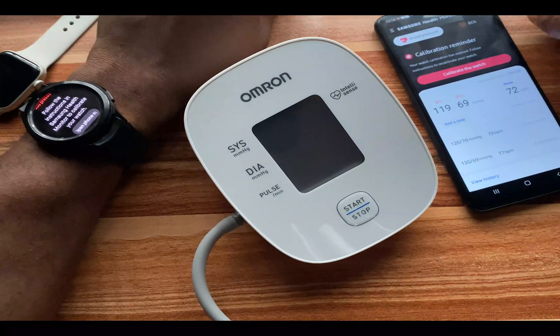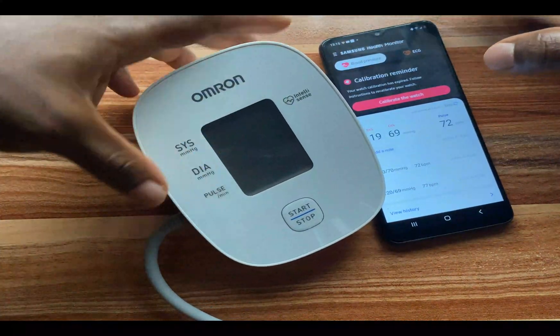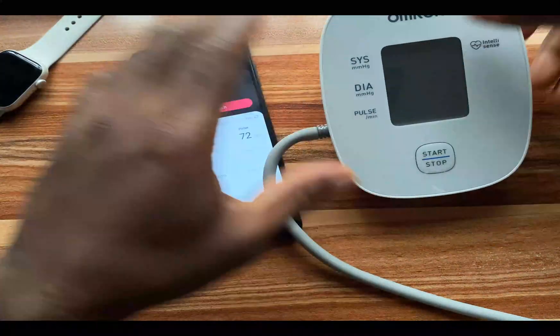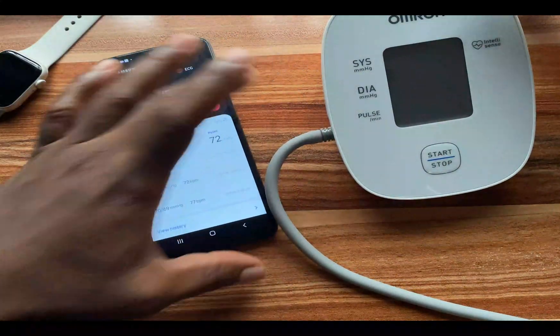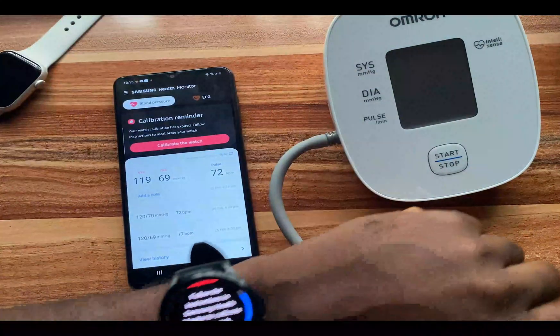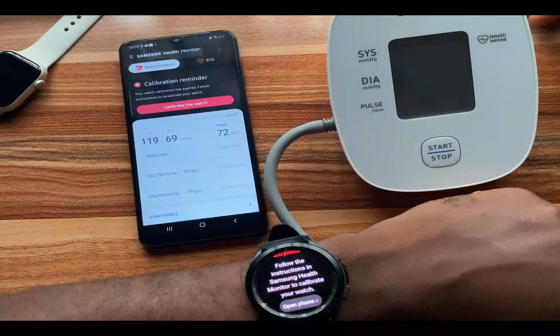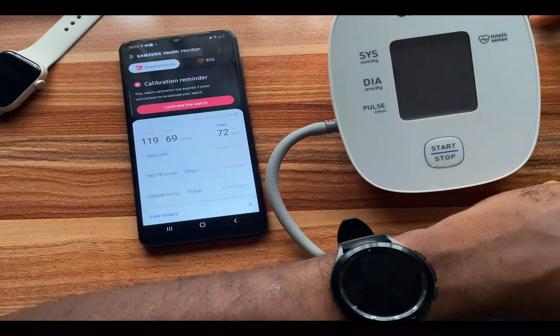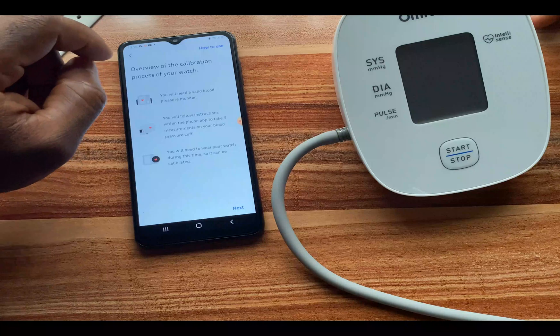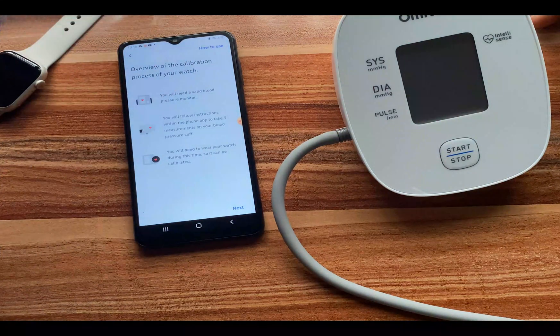I'm going to tap on 'Calibrate the Watch' so you can see this clearly. I'll tap on 'Calibrate the Watch' and it says 'Overview of the calibration process of your watch.'